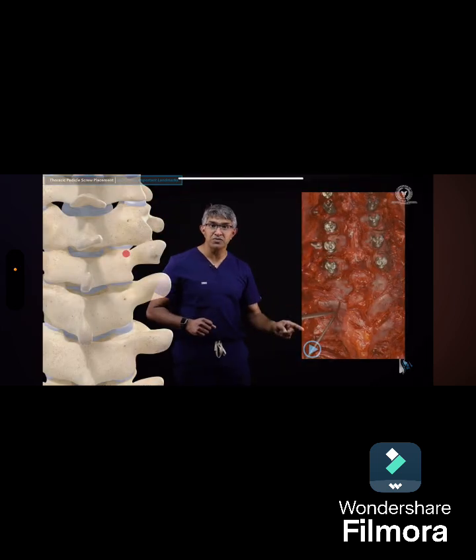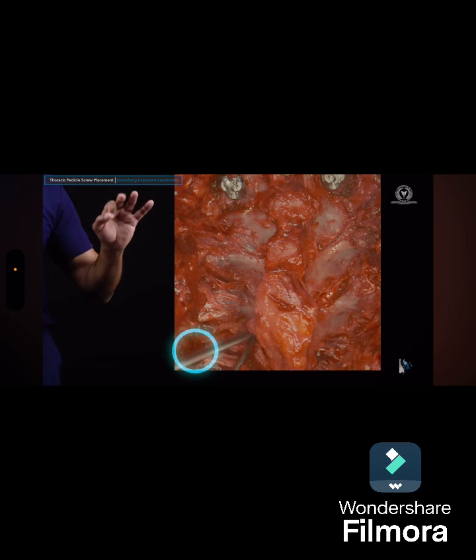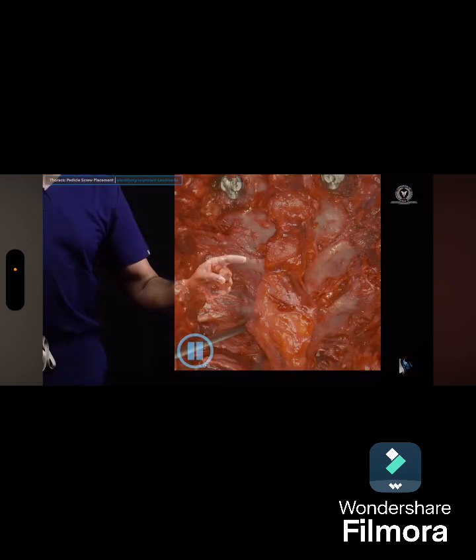Similarly, here's looking at the pars, the full width of the joint, the midpoint of the joint, and again, this is the range that's available to you when you're putting your pedicle screw in terms of medial to lateral distance. Now, again, as I had mentioned before, you can't necessarily see the ridge so well in this animation, but you can see it very clearly here. Here's the ridge that I was talking about.